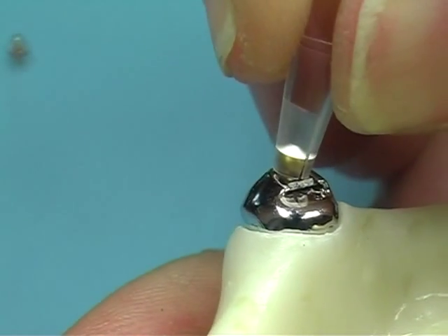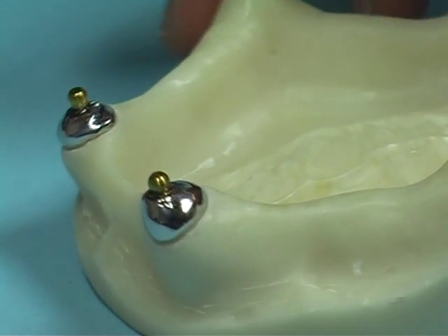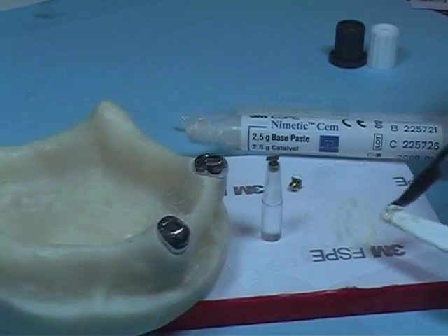Before cementing the sphere into the base on the cover, always remove any grease from surfaces. To glue the sphere, use a dual parts composite cement, non-light curing, or composite anaerobic cement.